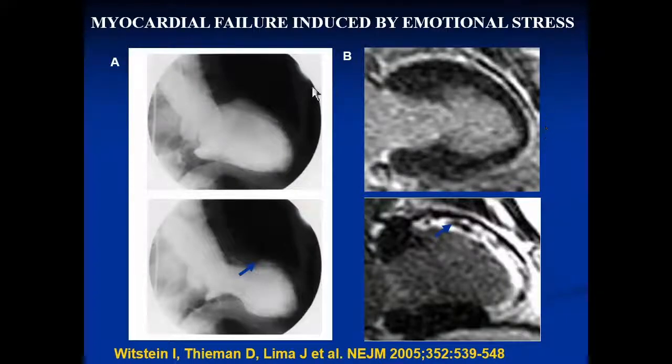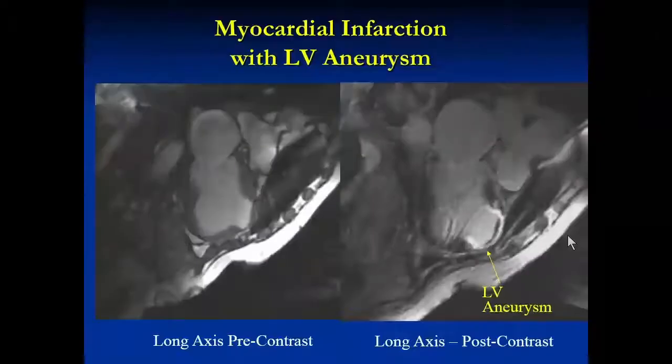If you don't see any delayed enhancement, a lot of dysfunction, recent onset, think stress cardiomyopathy. And in ischemia, you may have no delayed enhancement, but if that happens because the artery was opened very fast, you will know that. So if the following physician, the attending physician, doesn't tell you this story, this is the algorithm.